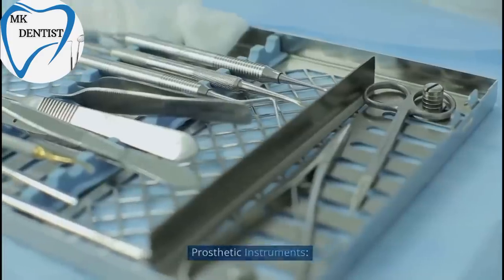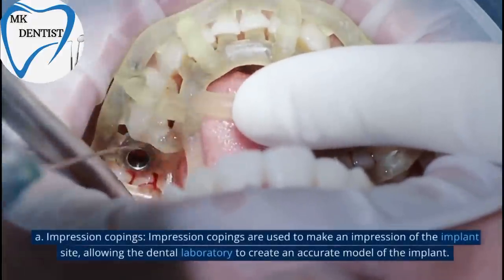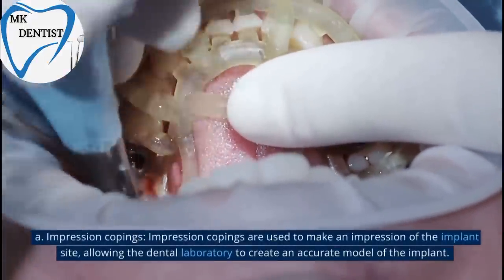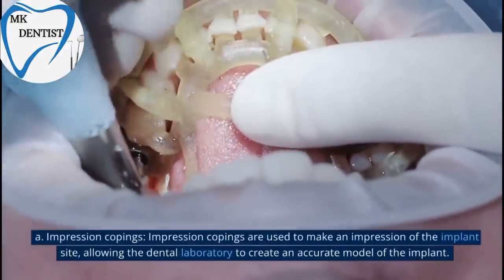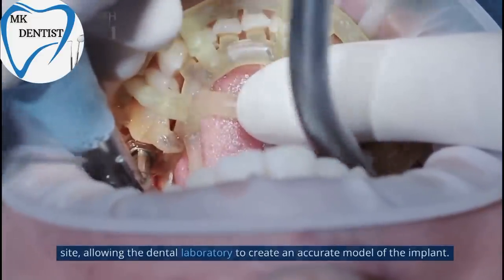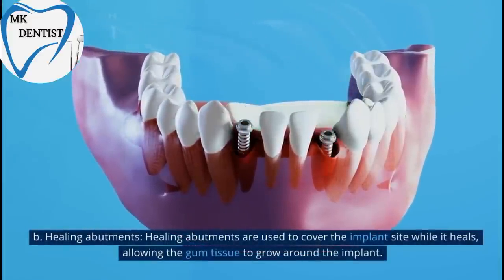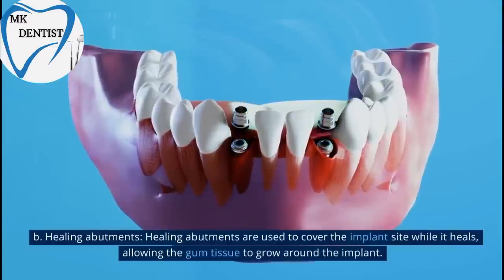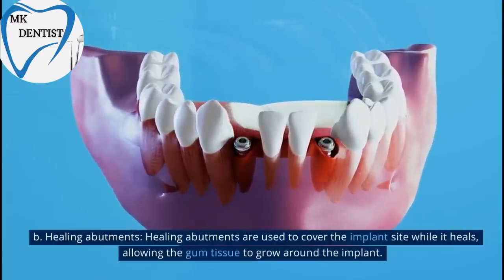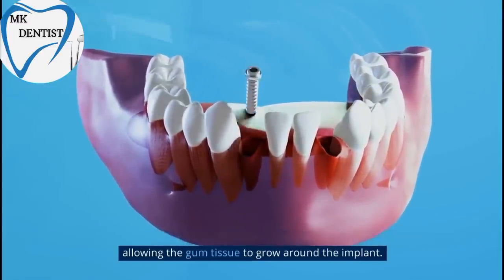Prosthetic Instruments. A. Impression Copings. Impression Copings are used to make an impression of the implant site, allowing the dental laboratory to create an accurate model of the implant. B. Healing Abutments. Healing Abutments are used to cover the implant site while it heals, allowing the gum tissue to grow around the implant.